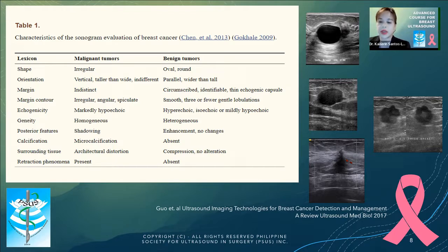After visualizing all the layers, usually we use ultrasound for the confirmation of already imaged lesions by our radio colleagues. And we also use ultrasound as our eyes during appropriate procedures such as percutaneous biopsies. These are ultrasound-guided fine needle aspiration biopsy or ultrasound-guided core needle biopsy.